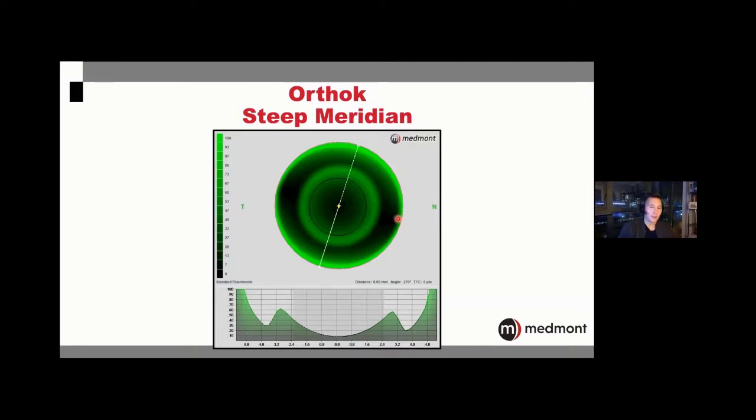That we're likely to see a lens that decenters. So we've maybe wasted the dispensing visit, assuming that maybe in the closed eye environment it would work, and then we waste the patient's post-treatment visit only to find out that the lens didn't work, and we should have trusted the topography and reconstructed, ordered the right first lens.